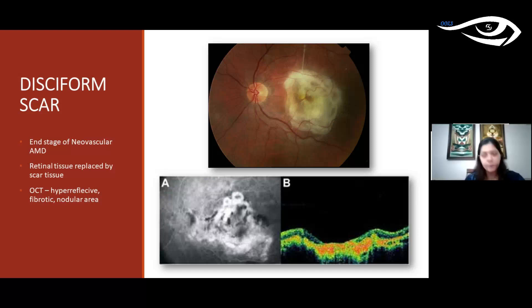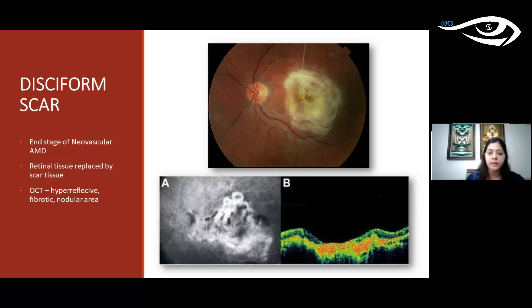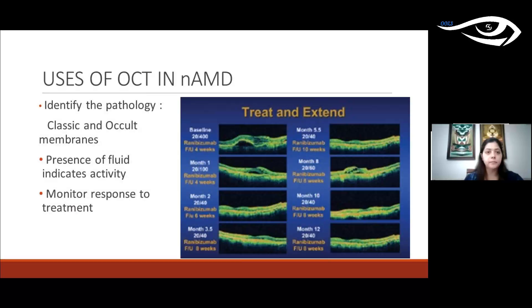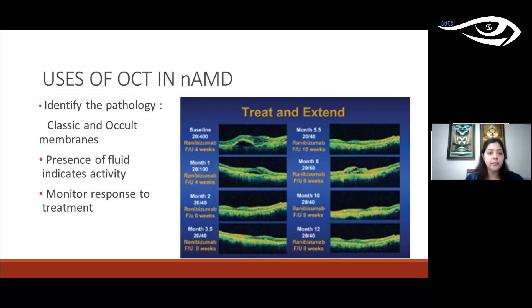The end process of wet AMD results in a disciform scar. On OCT, the entire retinal tissue is replaced by scar tissue — we see a hyper-reflective fibrotic nodular area with no distinguishable retinal or choroidal layers. OCT is useful in AMD to correctly identify the pathology and its layer, detect fluid indicating active membrane, and monitor response to treatment. CNVMs are treated with anti-VEGF agents, and OCT helps follow whether the agent is working and how membranes are regressing over time.